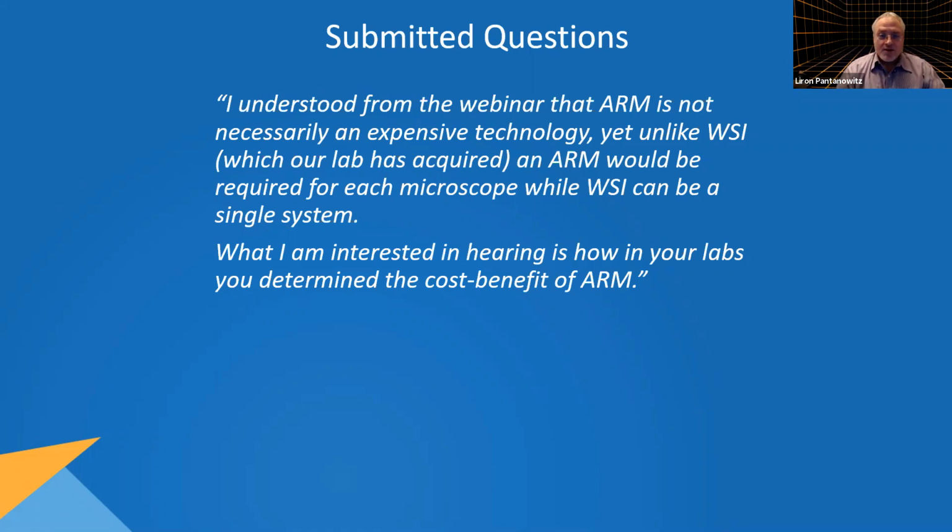And guess what? The slides don't scan themselves. So you have to actually pay an FTE person to scan that, pay their benefits every year. When you scale that up, it's more FTEs, and you need someone to manage all of that. So whether you're paying a central IT or someone to manage that, actually a WSI system is very expensive. To get started, we're talking millions of dollars up front, and then to maintain that operation.